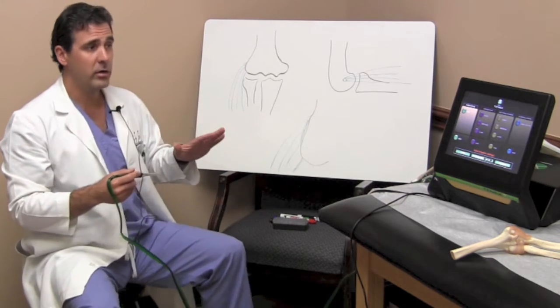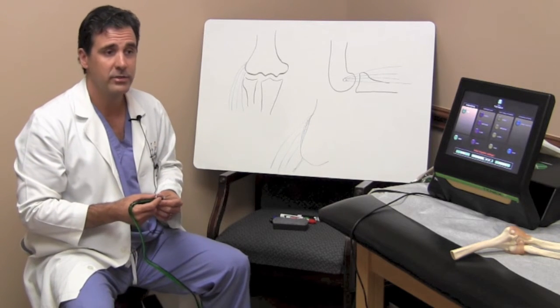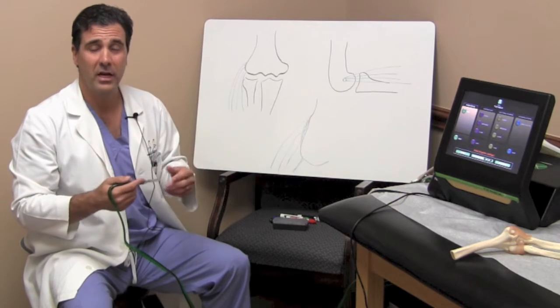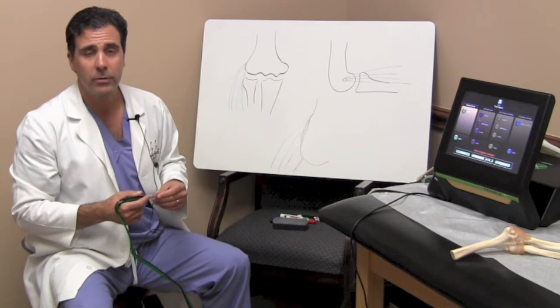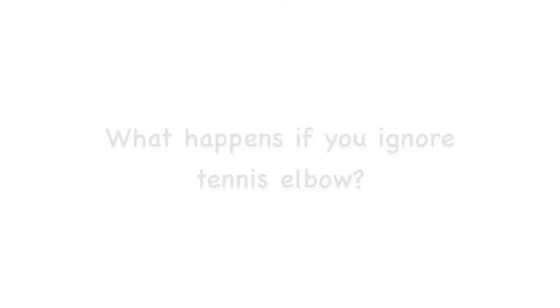This is also a quicker procedure. It takes about 20 to 30 minutes. Sometimes you can just do it under local, where you use a little conscious sedation and numb up the area. We typically prefer to do it in a sterile environment, but some doctors are probably using this in their office as well.